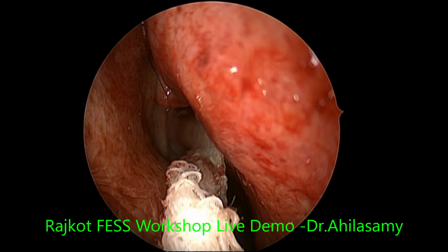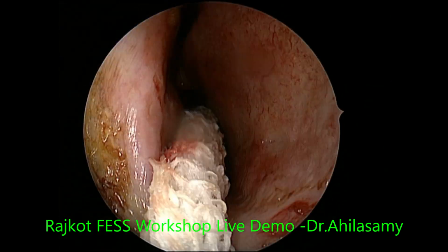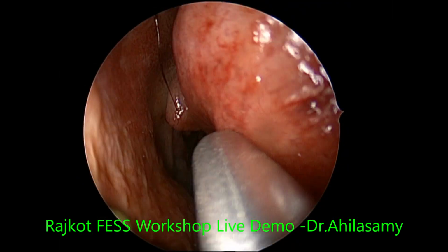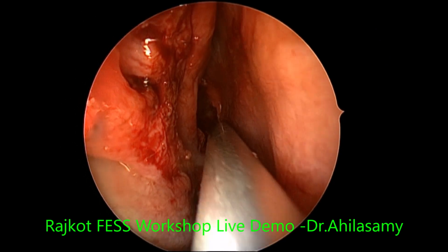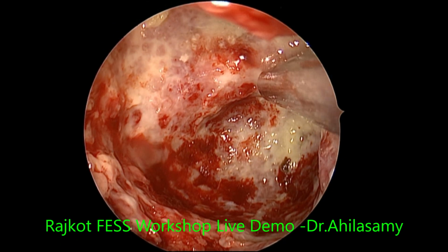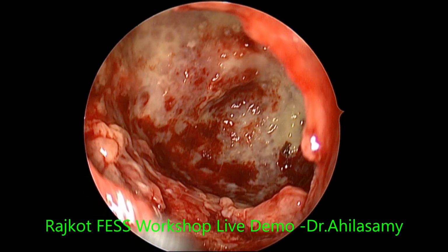Even if you leave it a little bit stuck, all the sticking yellow things are coming out. See, yellow things are coming out, and small bits of this mucosa will come out. And I put itraconazole 100 milligram BD for a week, for yesterday's case and this case. For sticking things, we can leave it.